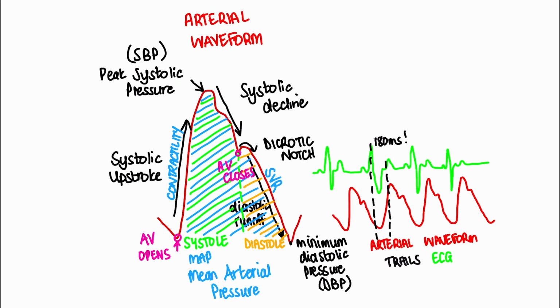You can see the cardiac cycle separated there with the green and the orange into systole and diastole, and the aortic valve closing is what separates it. In the next wave, the aortic valve will open at the bottom of that diastole, and then the next systole will happen.